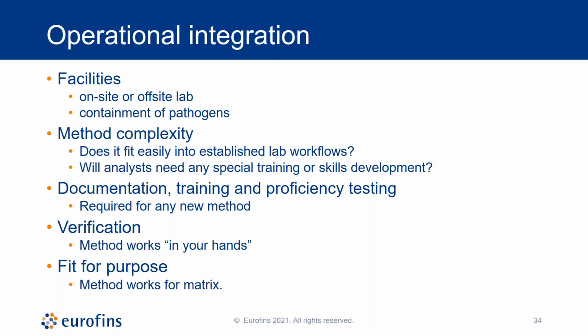Now, most of these rapid methods start with an upfront enrichment process. That will be very familiar to anybody running cultural methods. If, however, you're currently only running cultural methods, you may need some special training for your analysts, because there are definitely some techniques and some skills that are a little bit different running rapid methods as a class.